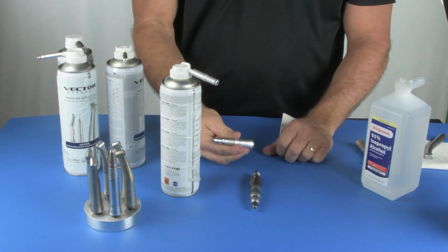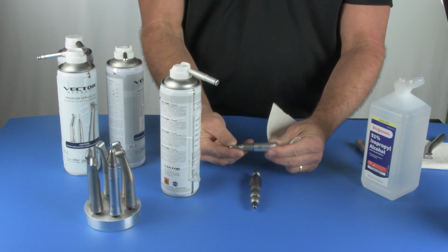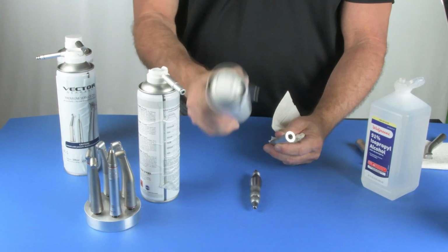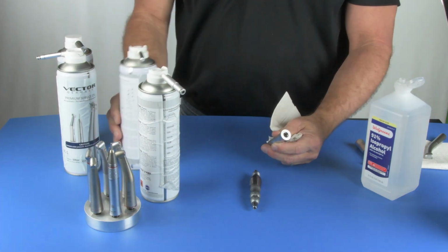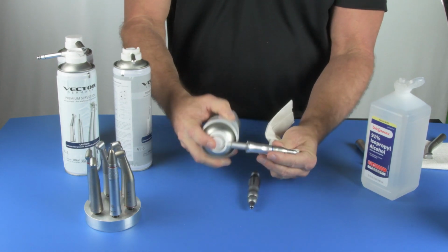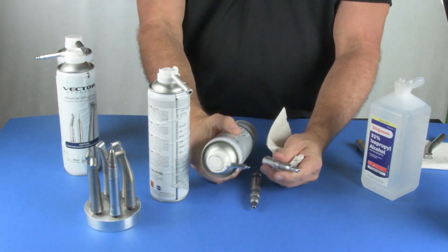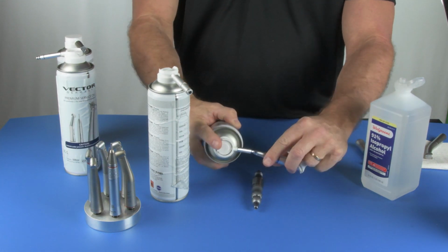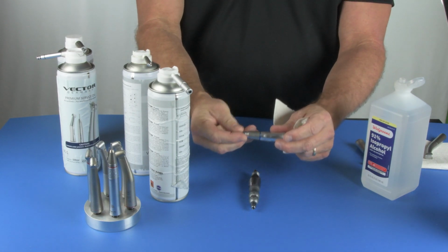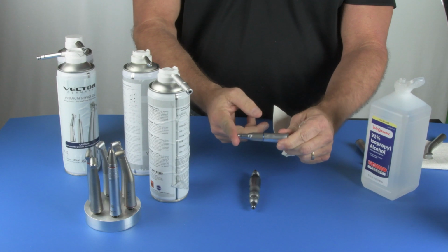Straight nose cones also generally require 2 different spray nozzles, and I'm going to show you which ones. Again, the E-type nozzle and the pointed nozzle. We'll start out with the E-type nozzle. The E-type nozzle fits on like so. Spray it for 2 seconds. Remove it. Take the pointed nozzle and go into where the burr goes and spray it for 2 seconds. Spray until it runs out clear. If it runs out dirty, or any type of dark oil, continue to spray until it's clear.